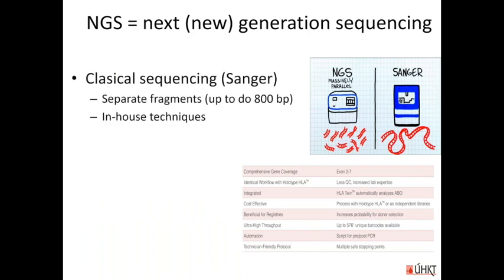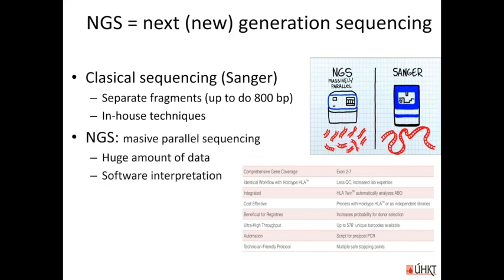And next generation sequencing is now coming to help us, and we are at the beginning of working with an NGS commercial kit from Omixon, which is using the Illumina platform and is examining the ABO gene in exons from exon 2 to exon 7. So we are now in the phase of the first tests, and we will be happy to present our results at other transfusion congresses.